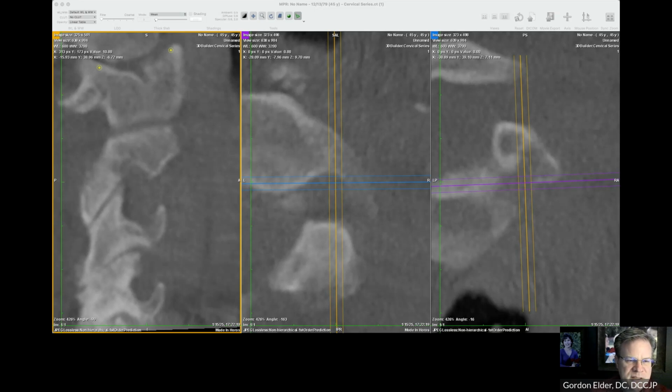Kobe, what's your general time to analyze? I've spent 30 minutes to over 1 hour. When I first started, I would spend over 1 hour and have a very simple analysis. Now I typically spend 50 to 60 minutes, but it's because I'm still experimenting and I'm still looking at things. If I wanted to get a really quick measurement and analysis of the joints, I could probably do it in 15 or 20 minutes now at this point. But again, I still take about an hour just because I'm looking at a lot of other measurements and trying to correlate them and come up with some better systems.